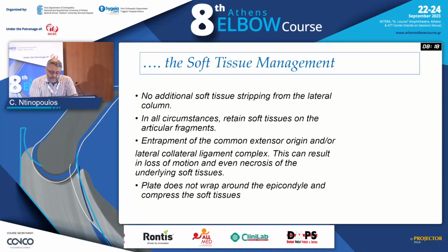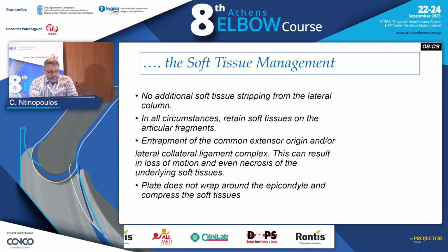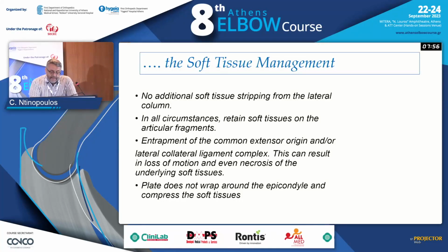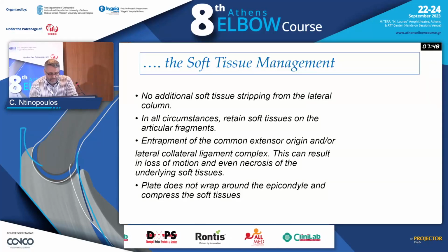The soft tissue management. We shouldn't strip soft tissue, especially from the lateral column. In all circumstances, we should retain soft tissues, especially on articular fragments. Putting the plate on top of the common extensor origin or on top of the lateral collateral ligament complex might create a necrosis of the area and loss of motion. Plates should not wrap around the epicondyle.